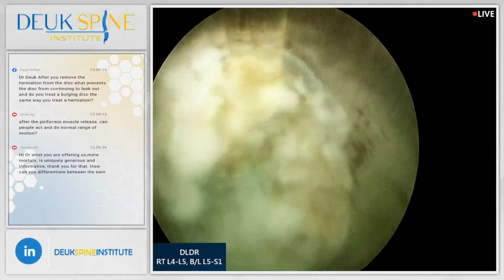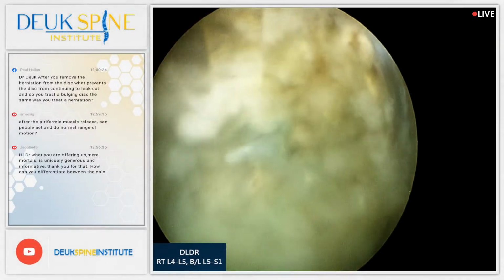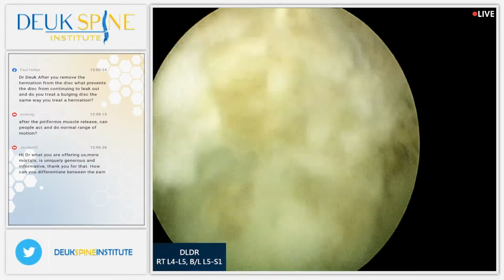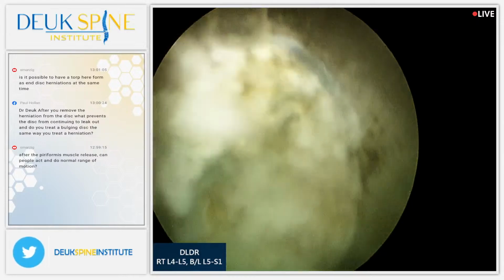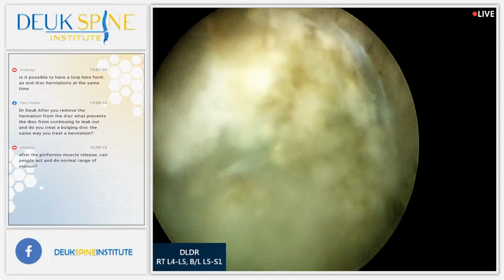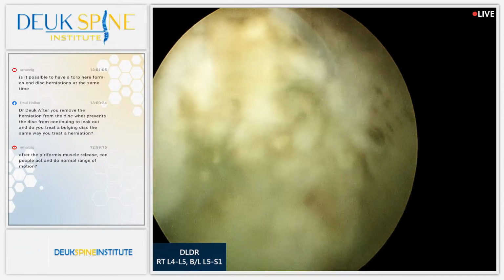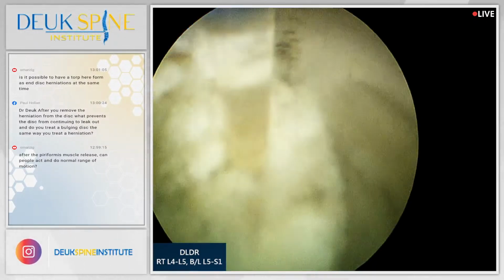I was able to get into the L5-S1 disc on both sides. Honestly, I don't know how I do it sometimes. I think it's God's will. Obviously, I don't know how I get into some of these discs, honestly. It seems superhuman to be able to get in. There's really no space to move the needle through. And we were just very fortunate to get into 5-1.